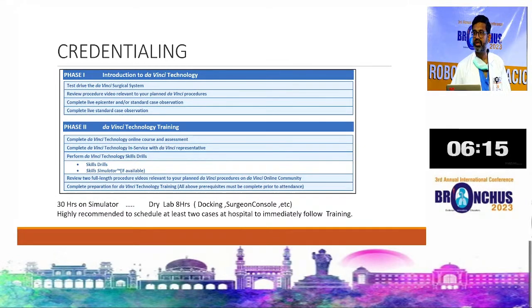You need credentialing. This is the data that I have taken. The Da Vinci people, the Intuitive people, were kind enough to share the data with me. So it's a four-step training process. The first step is where you have an interaction, they identify some potential in you, they look at your place and all that. So it's a basic interaction where you meet people and understand whether the program suits you and you suit the program.